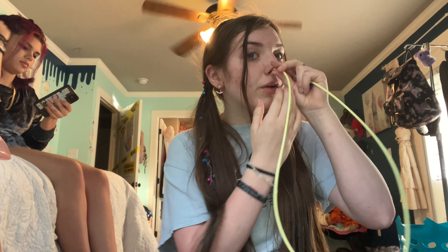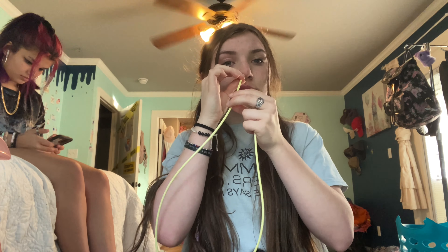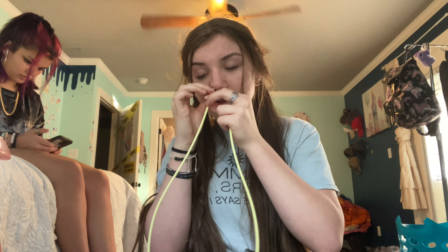Everybody has different positions they prefer. I just prefer to sit straight up. Some people lean back. I know one person on YouTube I learned from who said she likes to pull right here, and it works — so just whatever works for you. But swallowing the whole time does help a lot.